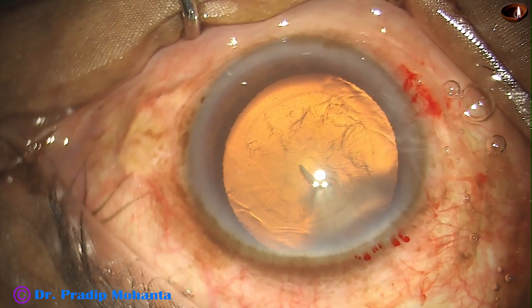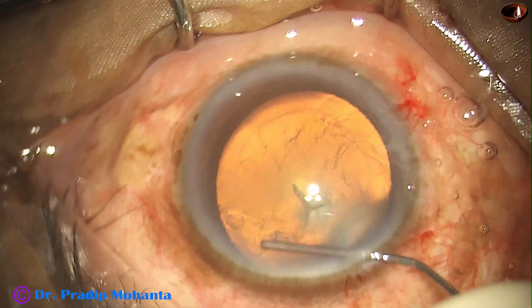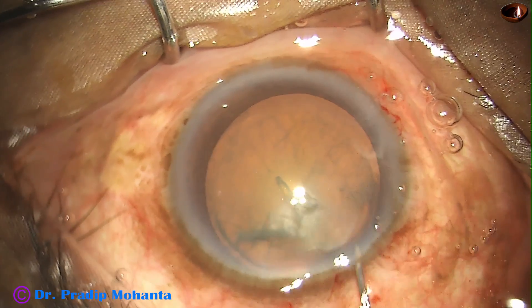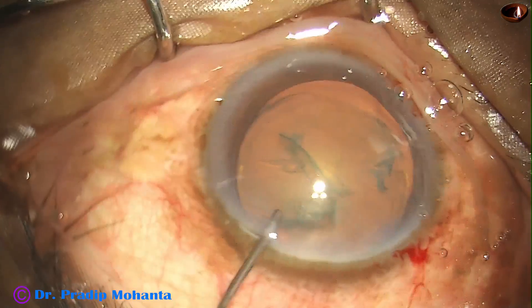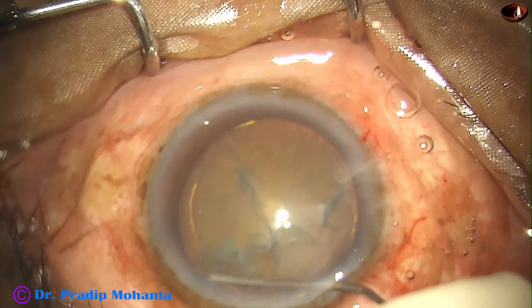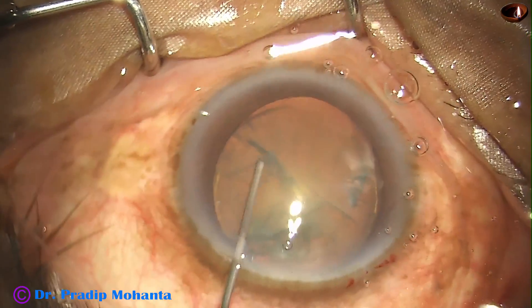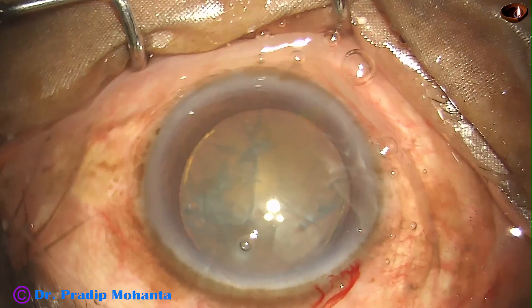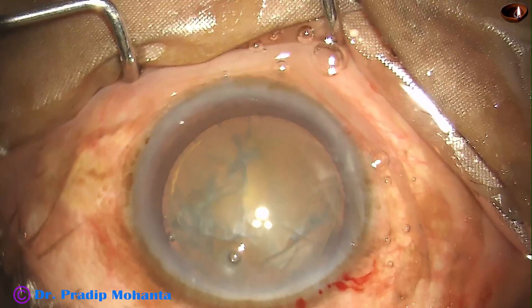See the beautiful red glow. The microscope being used is TrueGlow microscope from Appa Sami Associates. I am so happy to say this. The company that started with a cryo machine has come so far. This TrueGlow microscope has continuous zoom, XI, inbuilt beam splitter and recording system, and the price is so affordable.